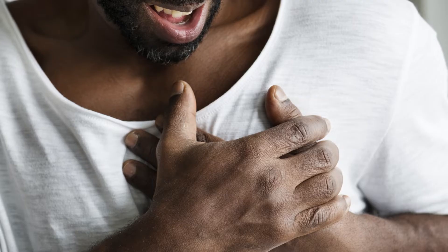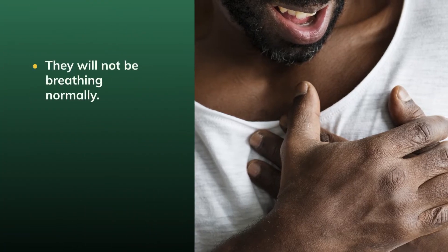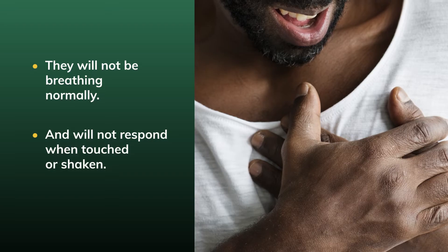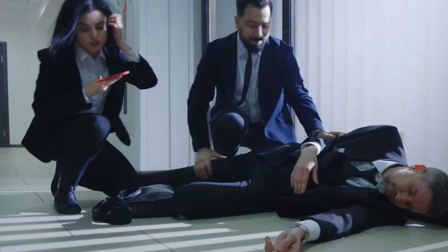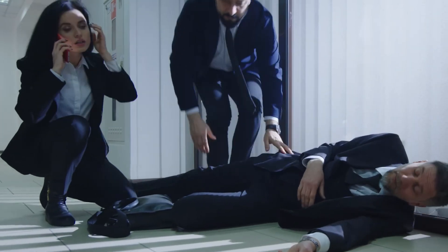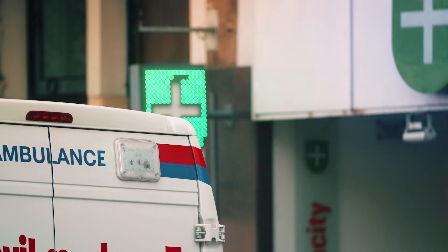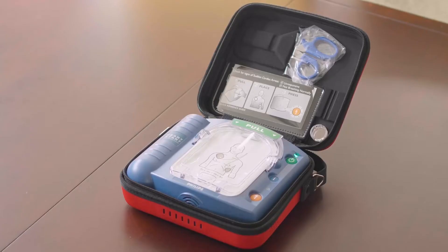If someone is suffering from sudden cardiac arrest, they will not be breathing normally and will not respond when touched or shaken. If there is more than one bystander available, have someone call emergency services while you set up the HeartStart Home AED. If nobody else is available, call emergency services first, then get the HeartStart Home AED.